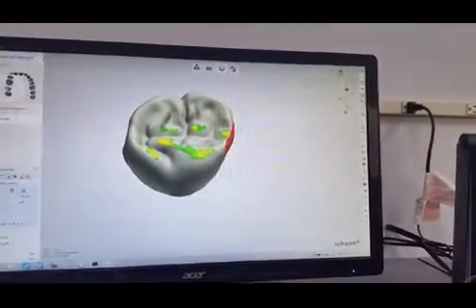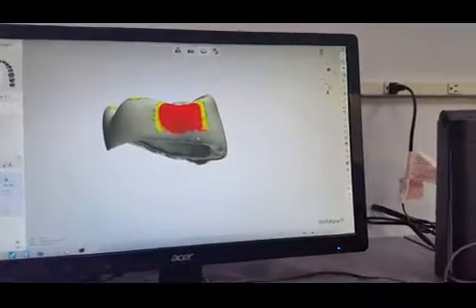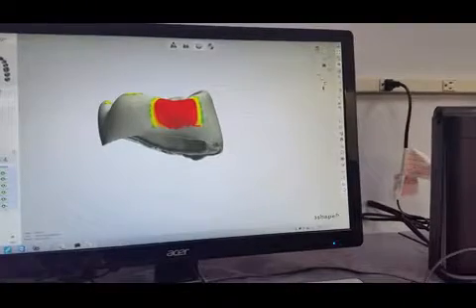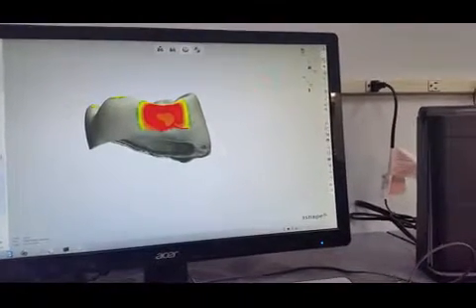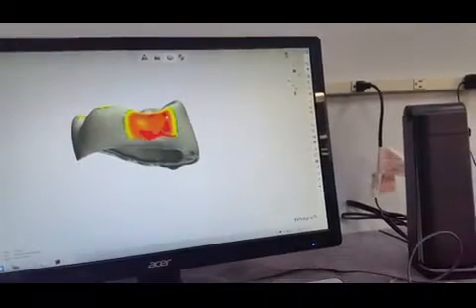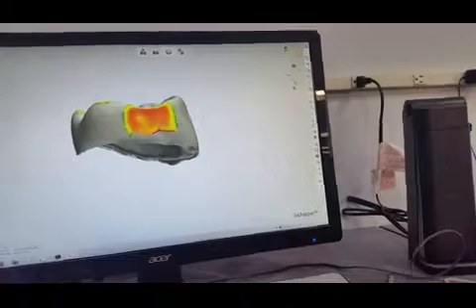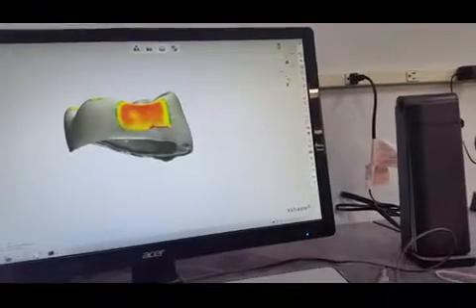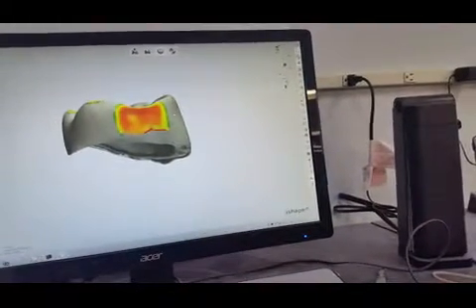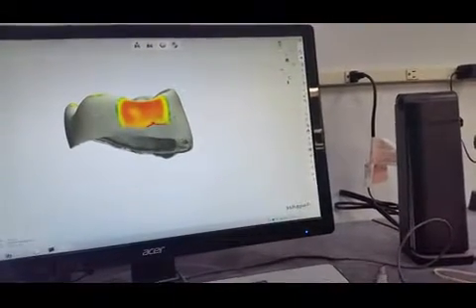Now we can do the contact. Yeah, that's pretty heavy here. And with the parameters that we got, I can hit it here and just kind of go back and do this. And as long as I have orange, I'm still going to have contact. I'm still going to have contact, but it's not going to be heavy at all. So I have broad light contact, and that's exactly what this account likes.